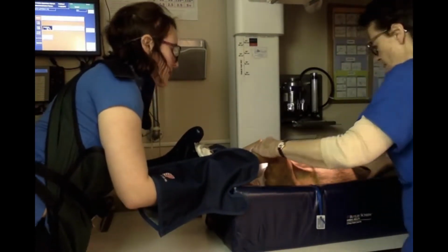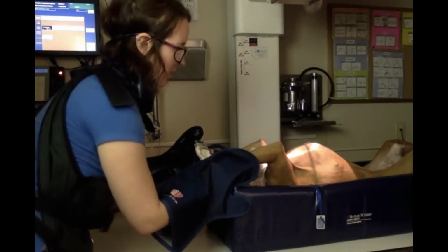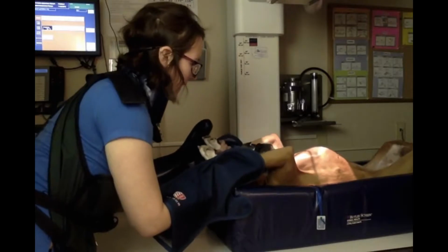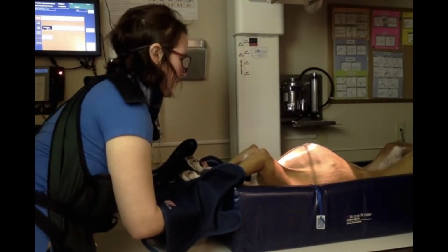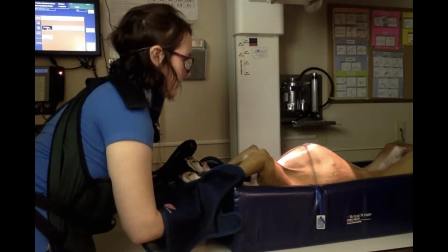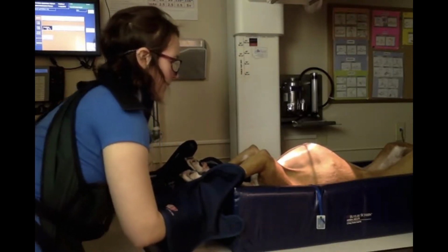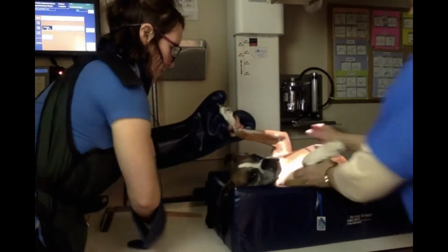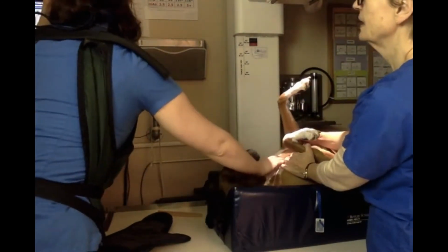All right, Georgia, so we have the bottom of her diaphragm down to her xiphoid process, all the way up through, hi, can you put your head back down? All right, and I'm going to go ahead and make sure I take the x-ray as she's inhaling, right there. All right, good girl, Georgia. You're sweet. There we go. Oh, and that's a nice view.